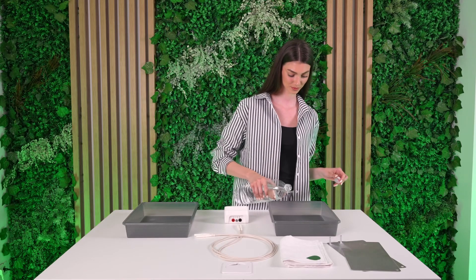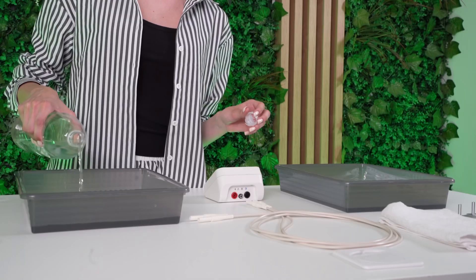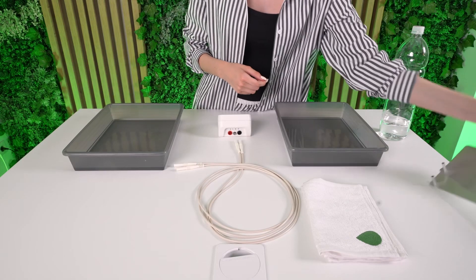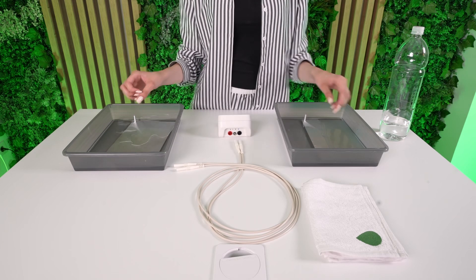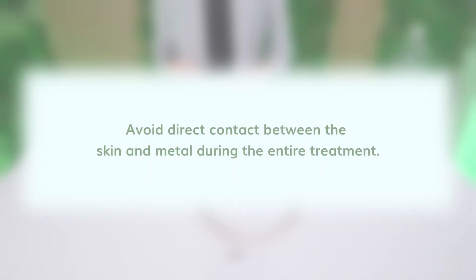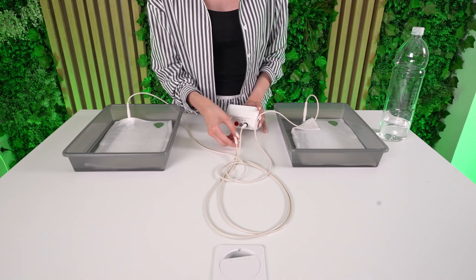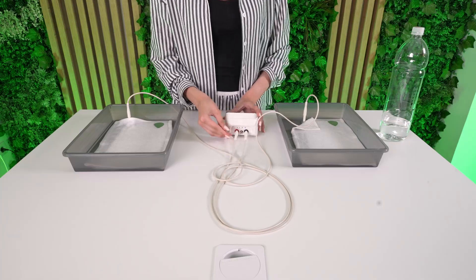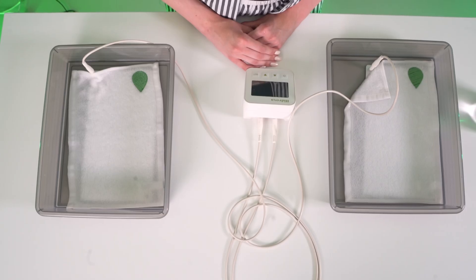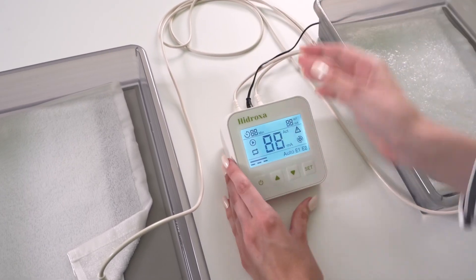Fill both trays with lukewarm water, just enough to cover your palms or soles. Place one electrode in each bin. Lay a towel on top so the metal is fully covered. Avoid direct contact between the skin and metal during the entire treatment. Connect the cables to the electrodes and plug them into the device. Plug in the adapter, power on, and set your preferences.